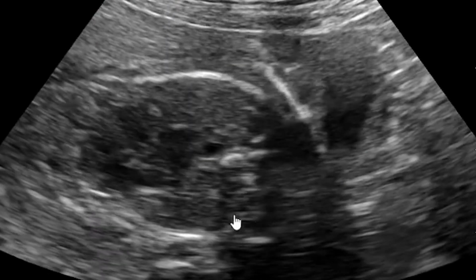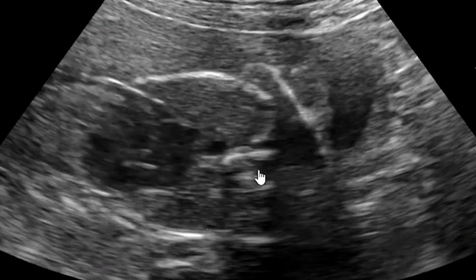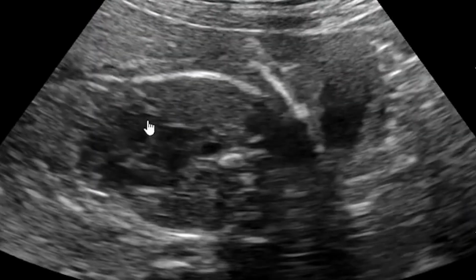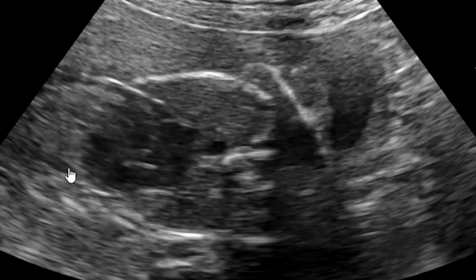What you are seeing here, this is the thorax, and this you can see is the spinal bone, and what you can see here is the heart. So you can see that the fetal heart, the apex of the heart, is actually beating outside the thoracic cavity. So when you have a case of this nature whereby the heart is found outside the thoracic cavity, either in the abdomen or just outside the thoracic cavity, we call that an ectopia cordis, or a heart at an ectopic site.